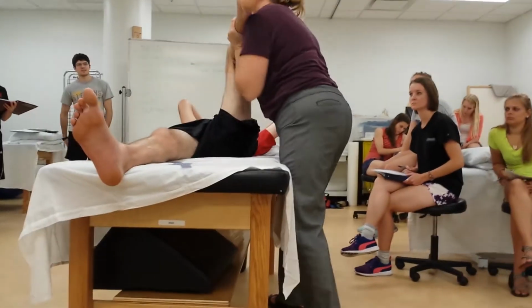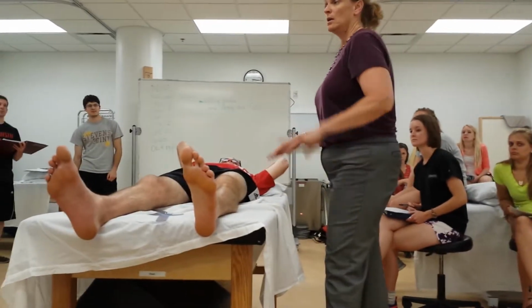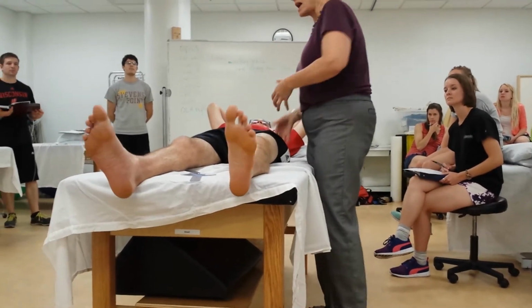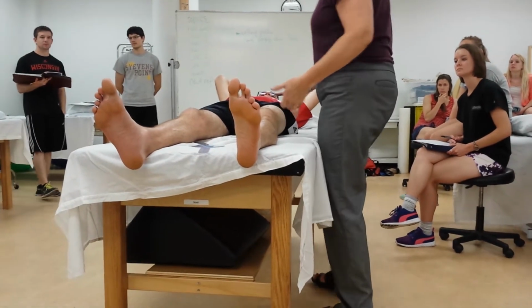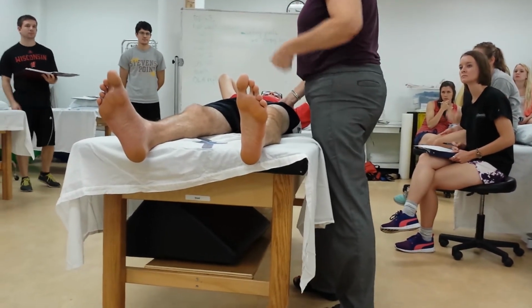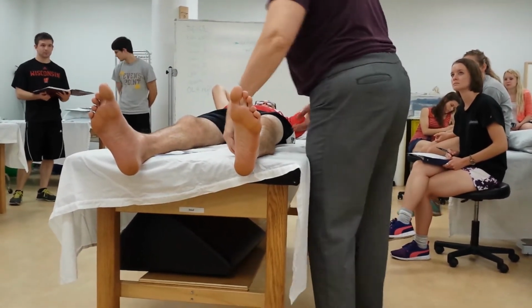Okay, and with it, I think that was more muscular than capsular. In class, you're going to feel both, depending on your person. You can see I took him a lot further. I had to take up the motion in his pelvis to be able to get to that end feel. If I simply tried to do the end feel without that, I would have to stabilize his pelvis pretty well if I was going to try to get an end feel at his normal end range of motion of just his hip joint. Okay?